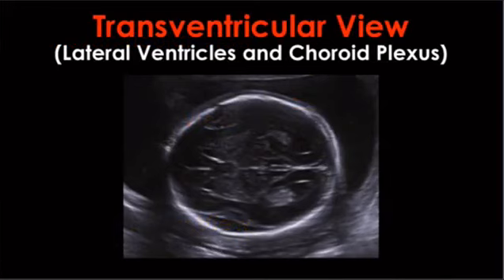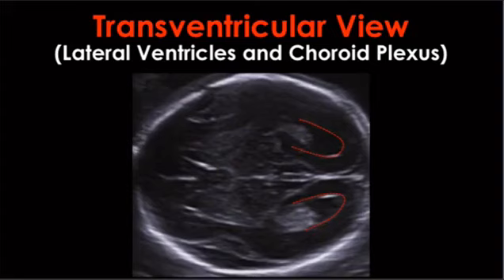So here we go. This is an axial slice through the lateral ventricles. It's attained at the level of the frontal horns. These guys, the frontal horns of the lateral ventricles, and the cavum septum pellucidum, which sort of looks like a little box there, and then you can see the atrium of the lateral ventricles. So this is the important part. I'll do a zoom up here. Remember that the atrium is the confluence of the temporal and occipital horns, and it contains these bright things, which are the echogenic choroid plexus.